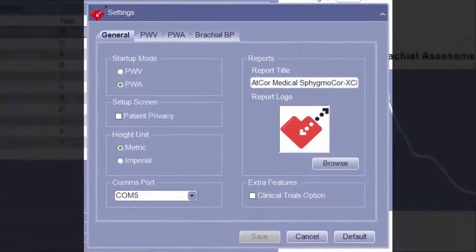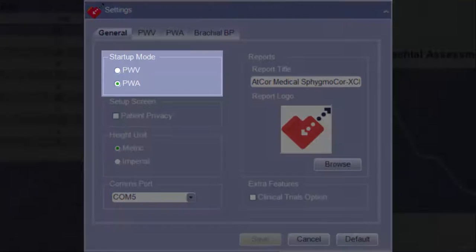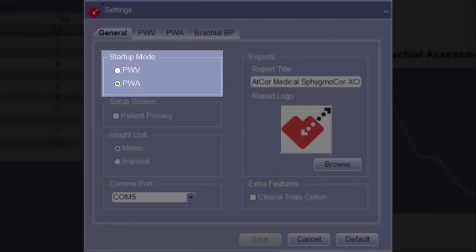The first tab of the Settings screen is the General tab. This tab has options that pertain to the overall Spigma Core software setup and report display. Under Startup Mode, the desired modality of either pulse wave velocity or pulse wave analysis can be selected for default loading when the software is launched.